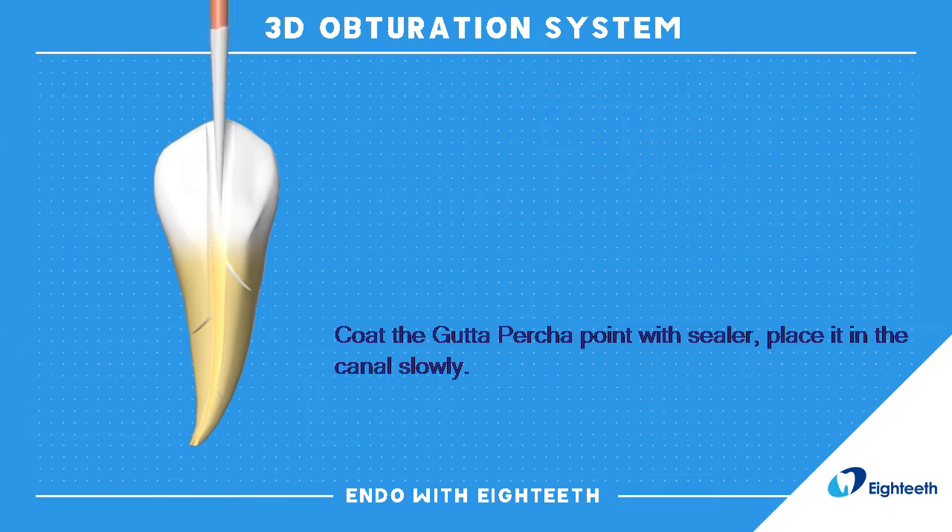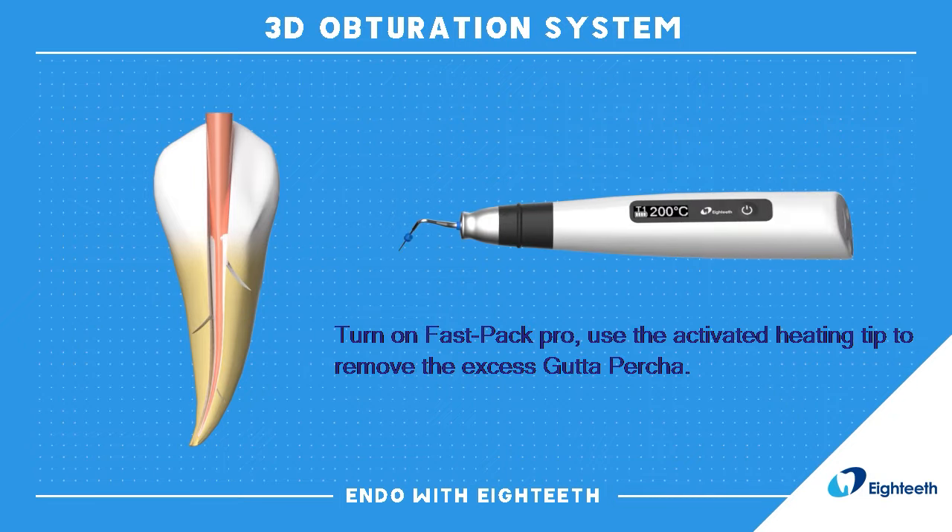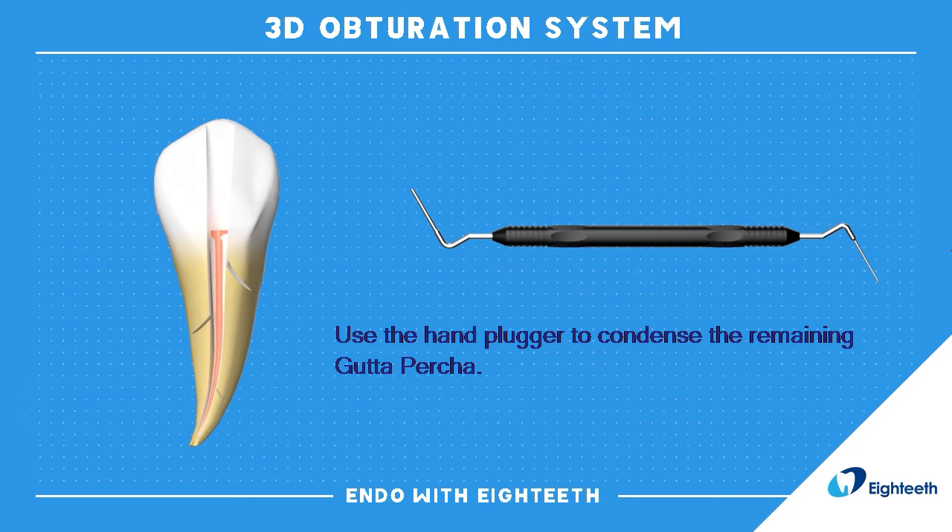Coat the gutta percha point with sealer and place it in the canal slowly. Turn on FastPak Pro. Use the activated heating tip to remove the excess gutta percha. Use the hand plugger to condense the remaining gutta percha.